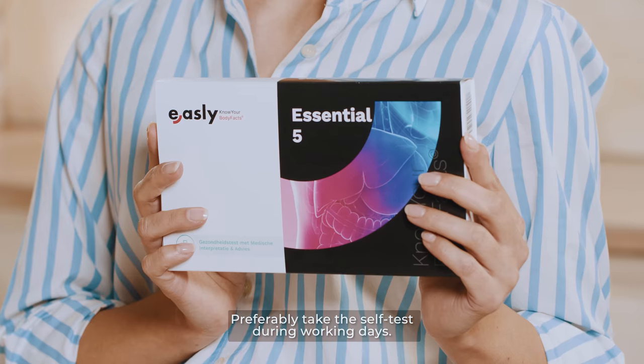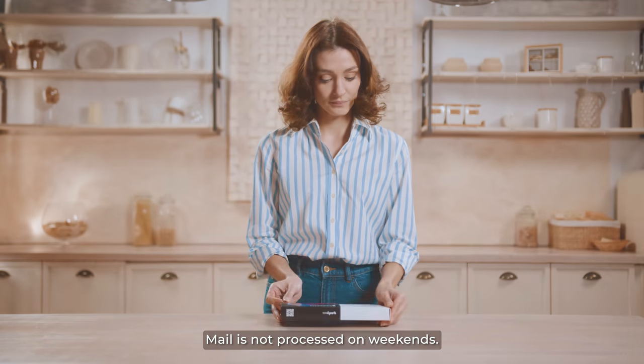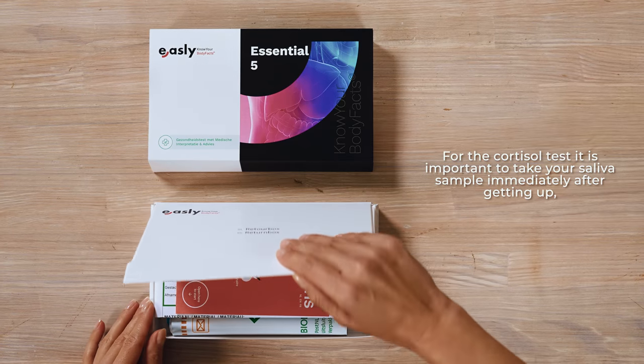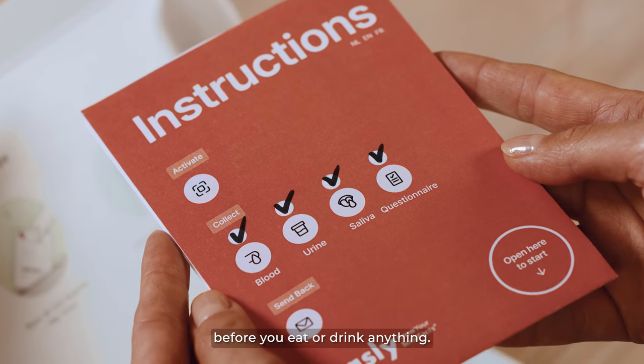Preferably take the self-test during working days, as mail is not processed on weekends. For the cortisol test, it is important to take your saliva sample immediately after getting up, before you eat or drink anything.